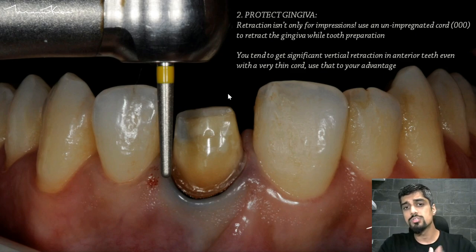Normally the recommended amount of time for gingival retraction is 5 to 7 minutes. Obviously if you are going to do tooth preparation with a retraction cord, the time is going to be much more. So you have to be careful — don't use chemicals which will cause permanent damage to the gingiva, such as necrosis of the gingiva.